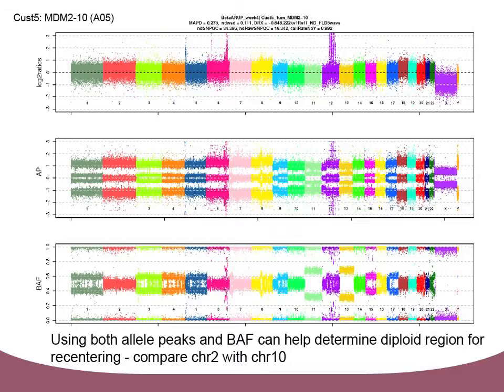And so some of you are like, I have to think about 2 ways of looking at these patterns, and believe me, it's not so bad. You just have to remember one is A minus B and the other one is the percentage of B.